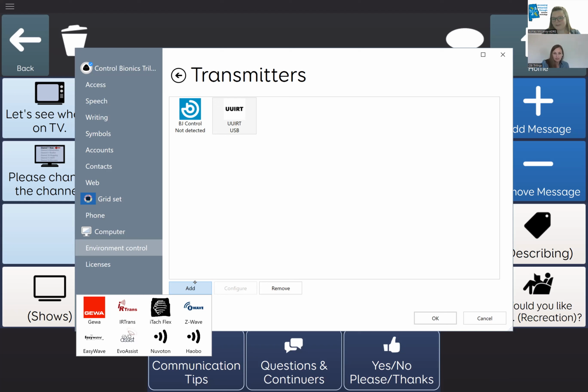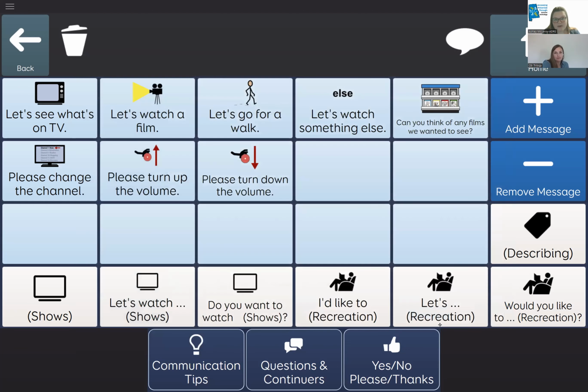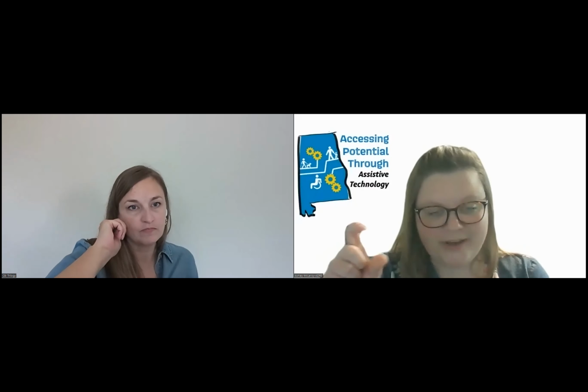If you're confused, you're not alone. So are we. I have bugged Lane for like 6 months about how to know which transmitter to use. The 2 transmitters that are showing up on her device, because she has the Neuro Trilogy, are those external adapters that you can purchase as an add-on. Now the device that I'm using right now is the GridPad, and the transmitters that showed up on mine were the Jiwa, I'm not sure how you pronounce it, and the IR trans.